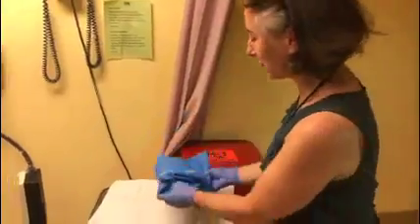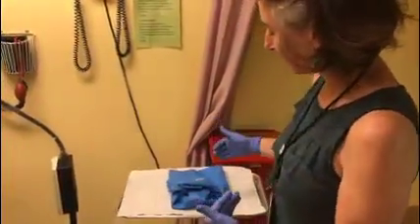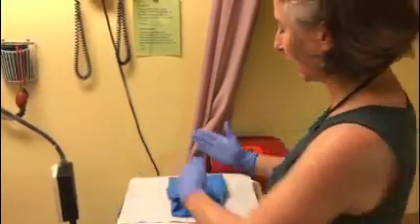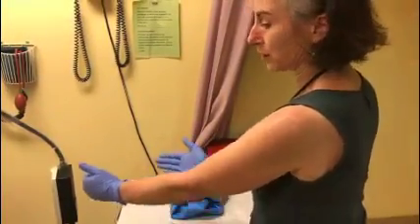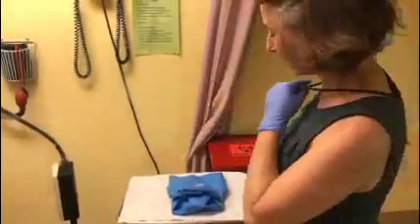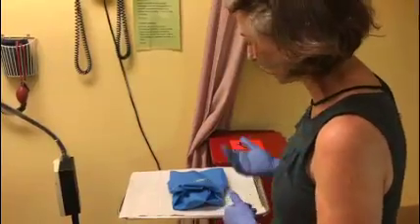Now we're going to open up the packaging. I set it down and think about how I'm going to set up my tray so that the handles are facing me when I am facing the patient. I'll have two sides of my tray — a clean side closer to the patient, and a sterile side further from the patient. I put my IUD to the back so I don't inadvertently contaminate the tray while I'm opening it up.